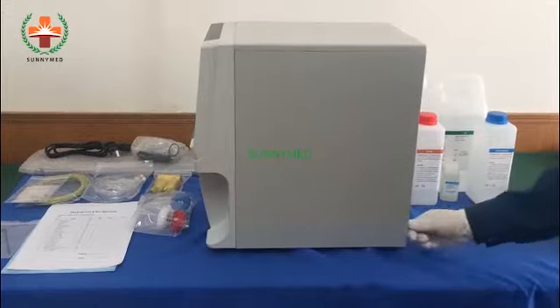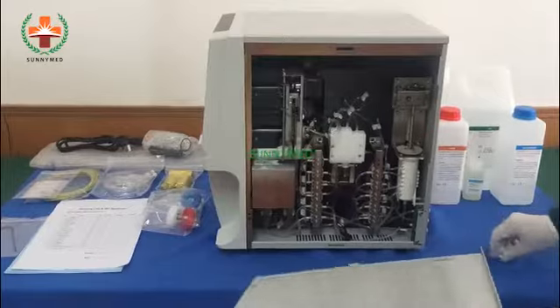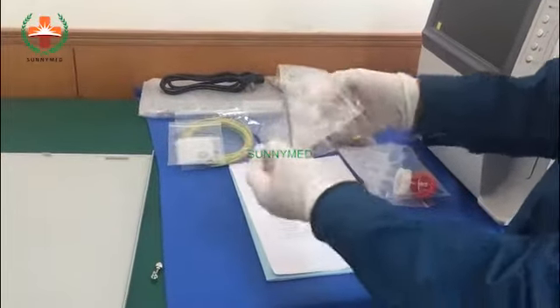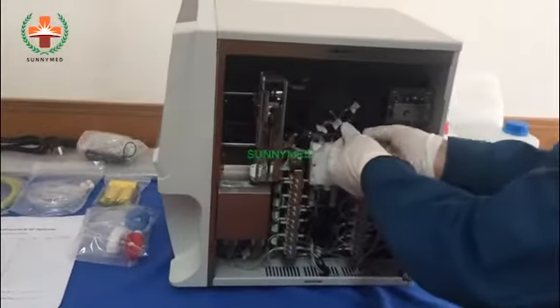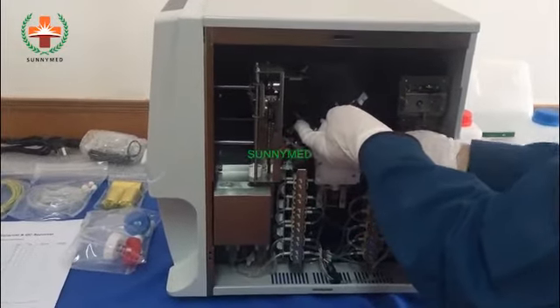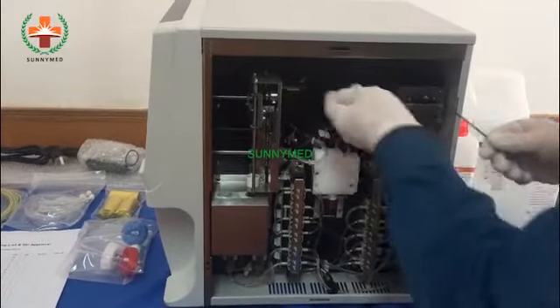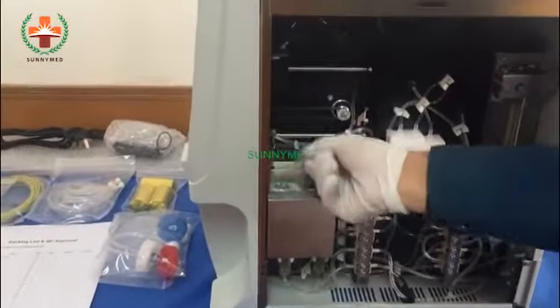Close two screws on the right panel of the machine to take the right panel off. Find the spanner in the accessories. Loosen the screw, take the iron sheet upside, then tighten the screw. Move the carriage to the front. Tear off the white tab.